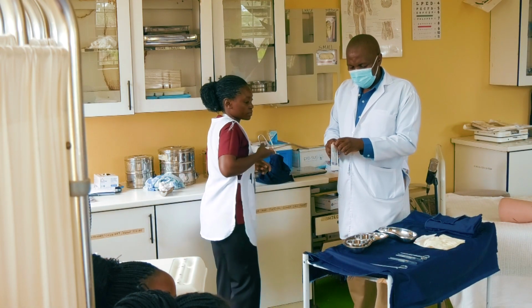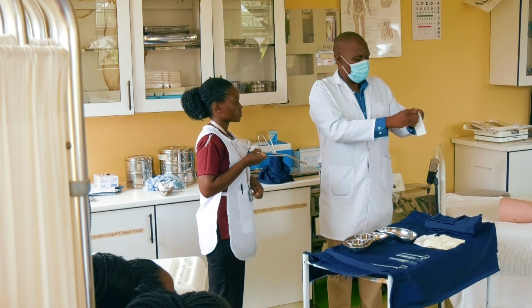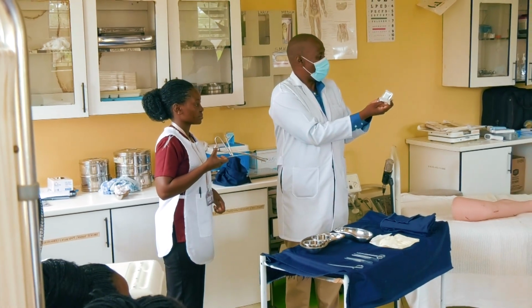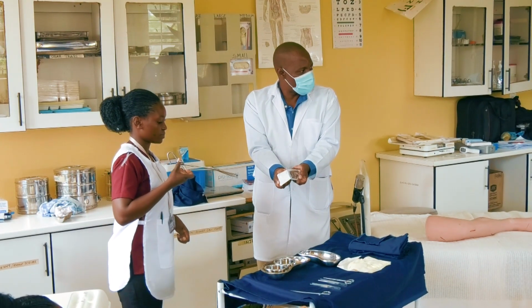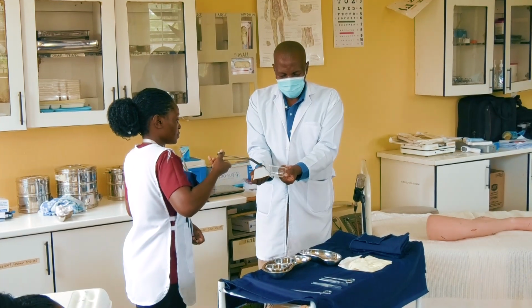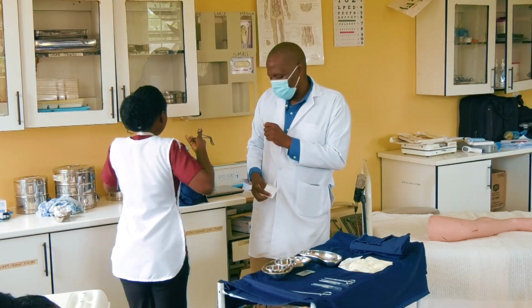Okay. So, opening, I just want to demonstrate this. I'm supposed to get this. When you're opening, you do like that. You are not supposed to come near this sterile suture sachet that you are getting. You go on the side, then the owner of the procedure receives it, okay, then drops it on the sterile trolley. You can put it back.